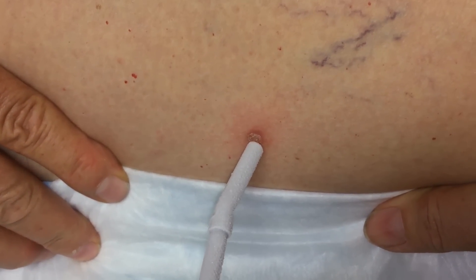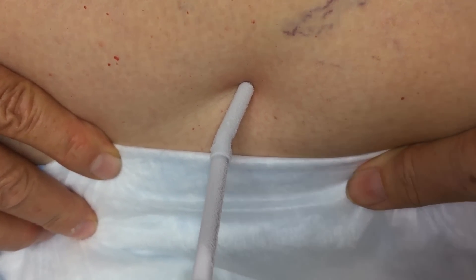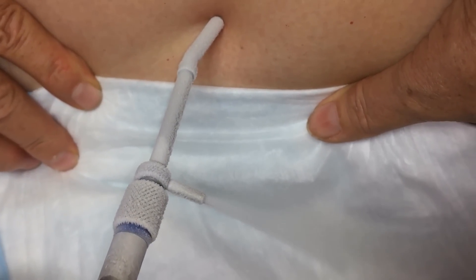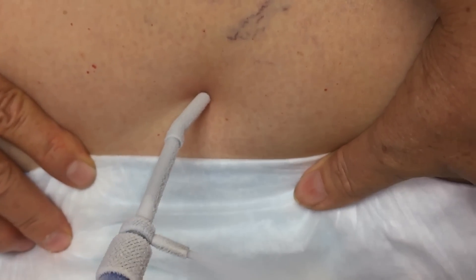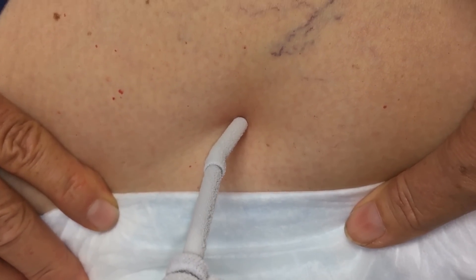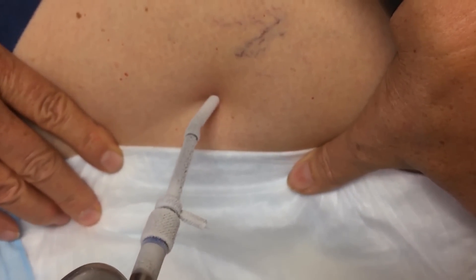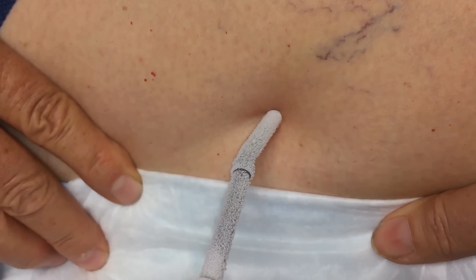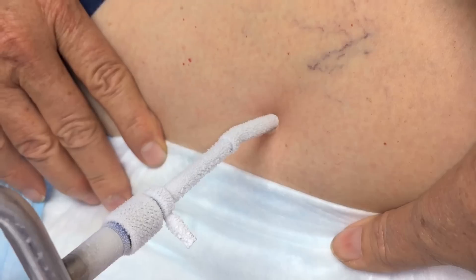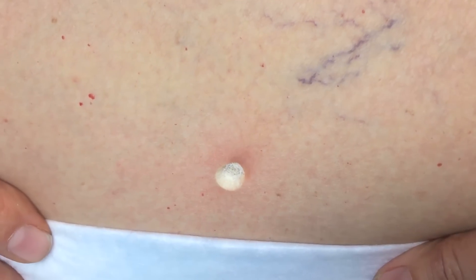Just a repeat of exactly what we did. I'll line it up really well here, push in on it. I'm also going to take off some of the ice on the probe here.